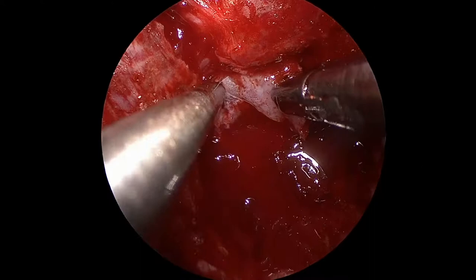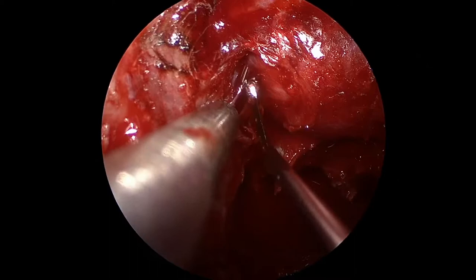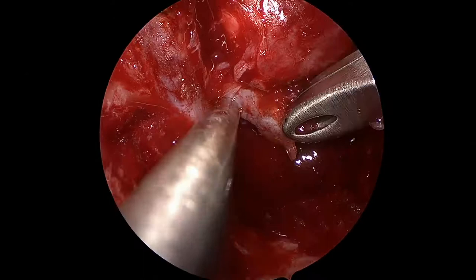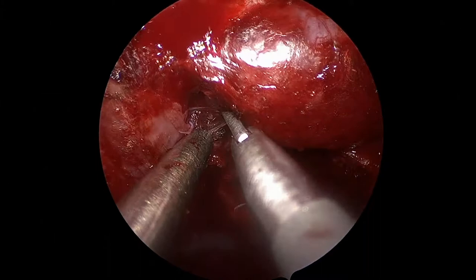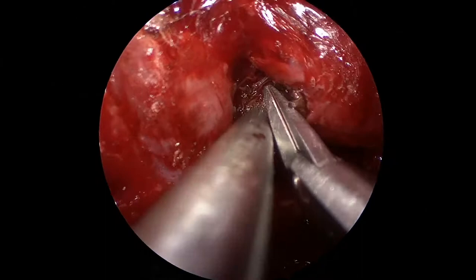I'm trying to carefully dissect the posterior clinoid from the dura, but the dural attachments are very robust. I'm seeing now the inferior paracellar ligament. This is being transected — it attaches the medial wall of the cavernous sinus to the carotid. After transecting this ligament, I can now mobilize better the posterior clinoid and the medial wall of the cavernous sinus. But still, we have the attachment by the inferior hypophyseal artery, which I have to coagulate and transect. After this, I can finally cut the dura that surrounds the posterior clinoid.